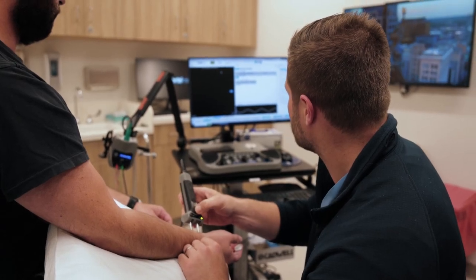Electrodiagnostics, or nerve conduction study and electromyography (EMG), is an outpatient diagnostic nerve test. It tests the peripheral nerve — the nerve from the spinal cord down into the arm or the leg — checking the speed of the nerve, the strength of the nerve, and whether that signal is present or absent.